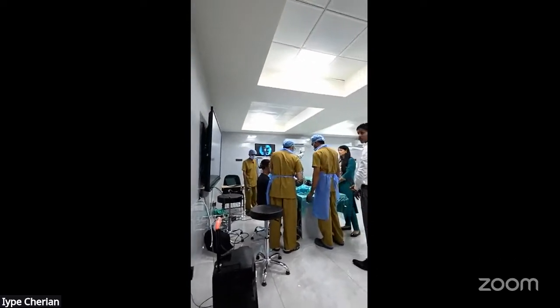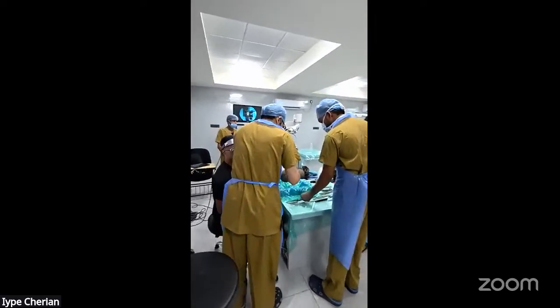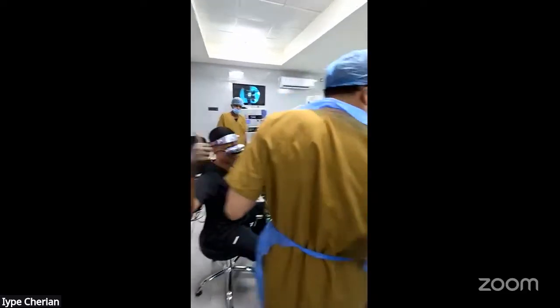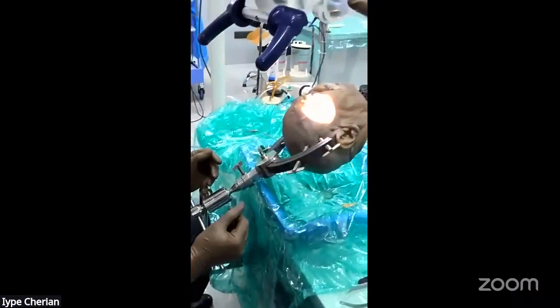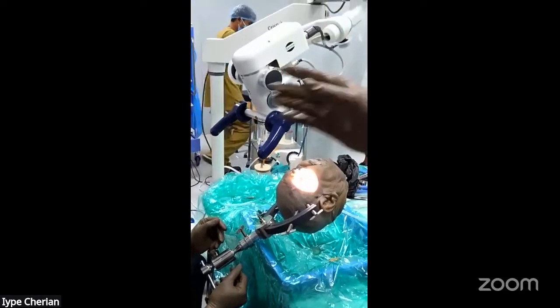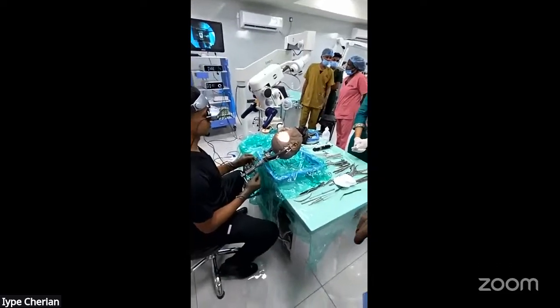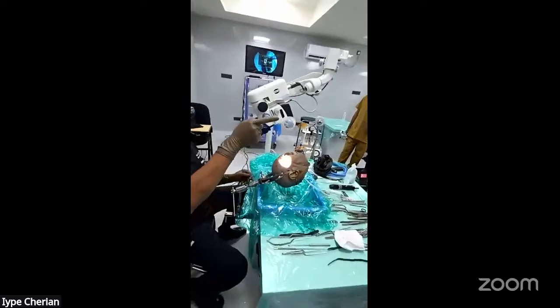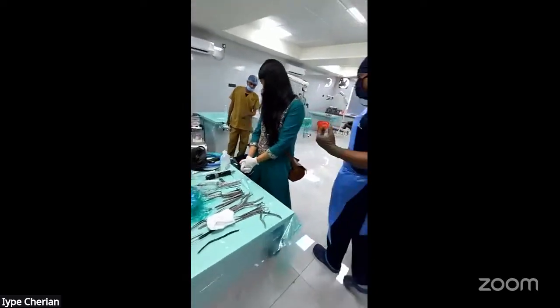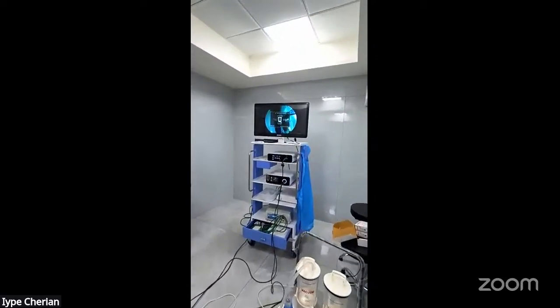And you can see, one second, he is sitting here and performing a dissection. We have a Sujita frame as well, 3D technology with the head vision. This is a hyper exoscopic vision, and the head is being fixed with the Sujita frame. They have machine vision, machine learning, and everything. The headset is there. And you can see this is our endoscope, a 3D endoscope.